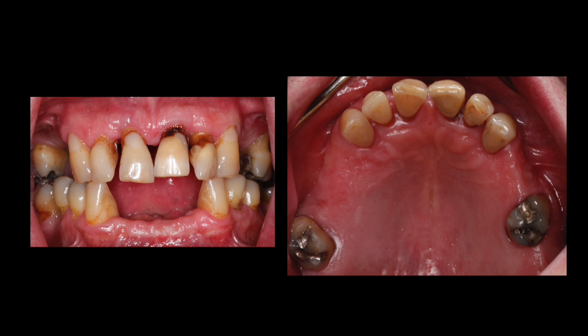What we started out with this patient was taking him through our protocol of diagnosis and treatment planning. His initial visit consisted of extraoral pictures, intraoral pictures, a comprehensive exam, and radiographs. What I wanted to do with this case was present an overall digital treatment protocol where we don't fabricate any diagnostic casts or even working or final casts in order to fabricate the patient's temporary.